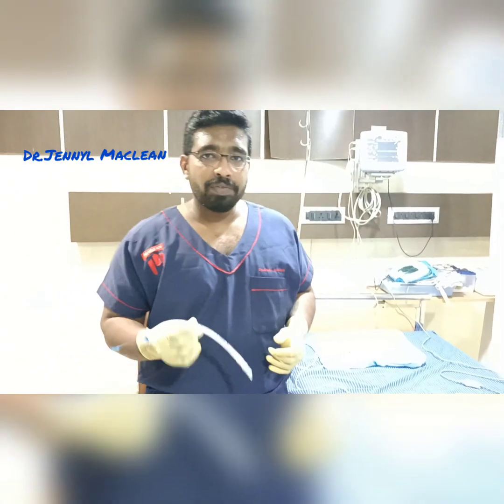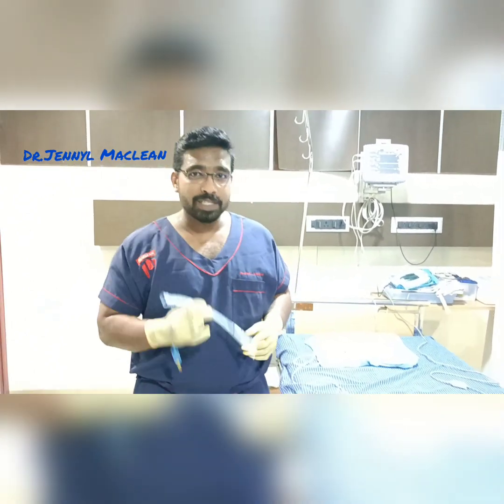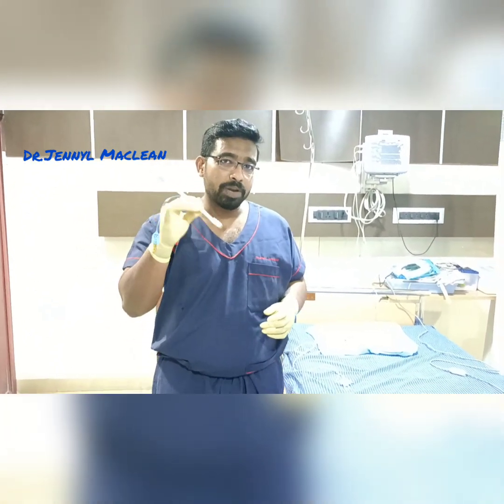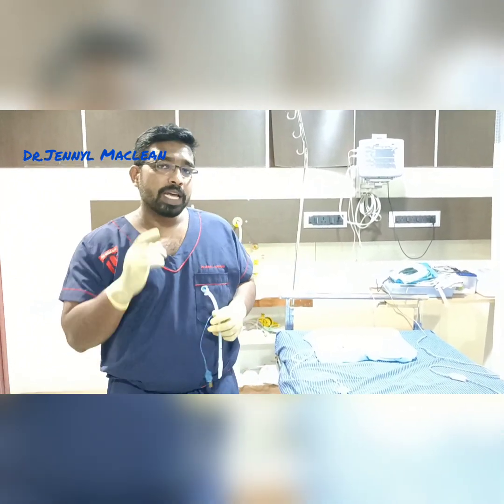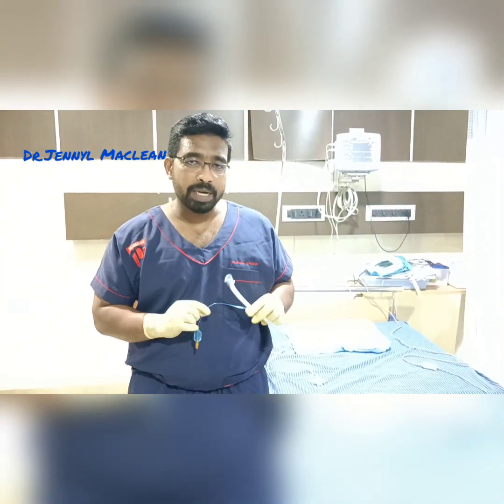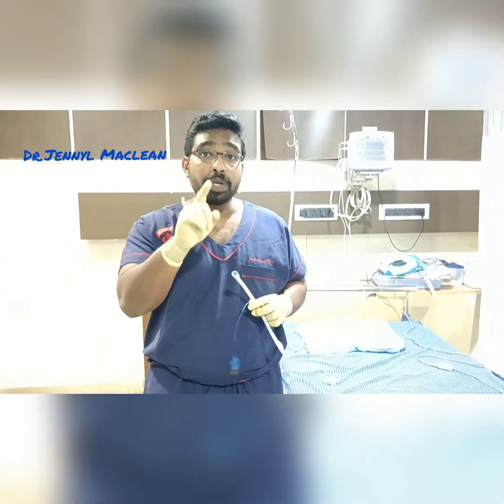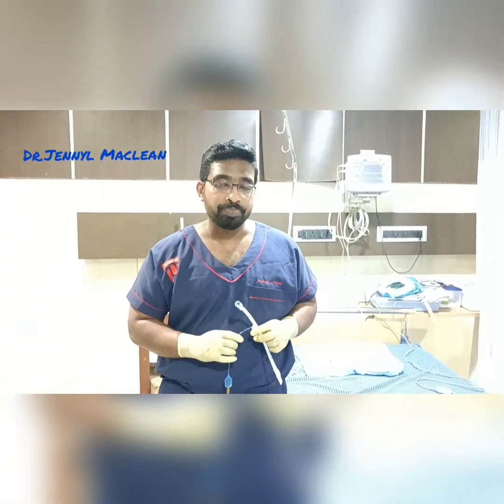Hello friends, today we are going to see nothing new — an age old thing: blind nasal intubation. I have used a 6.5mm endotracheal tube. I want to prove to the whole world that blind nasal intubation can be done in a very conscious patient when you have a successful airway topical anesthesia.